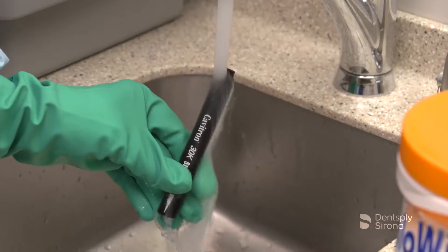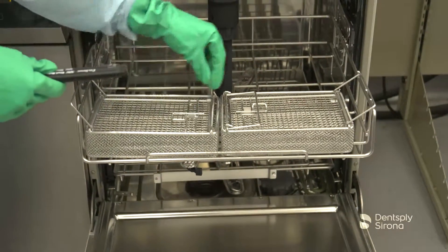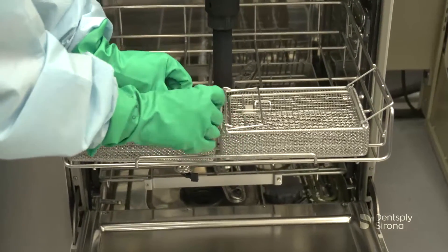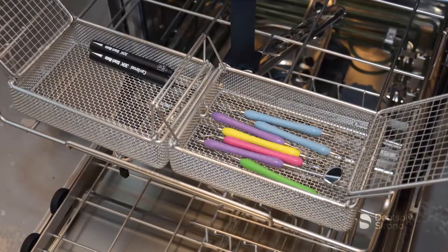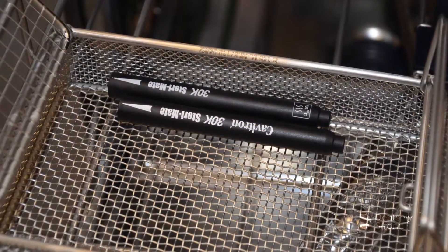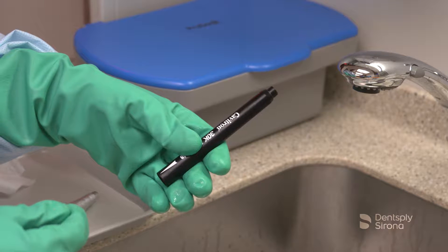After disinfecting the handpiece, rinse under running water for 30 seconds. Dry the handpiece with a disposable towel. SteriMate handpieces can also be cleaned and disinfected in automated instrument washers. For cleaning and disinfection in an instrument washer disinfector, always follow the manufacturer's instructions for use, making sure to observe the concentration rates and contact times, as well as the recommended cleaning and thermal high-level disinfection cycle. After the dry cycle is complete, always inspect for remaining debris. If debris is still visible, repeat the washer disinfector cycle.